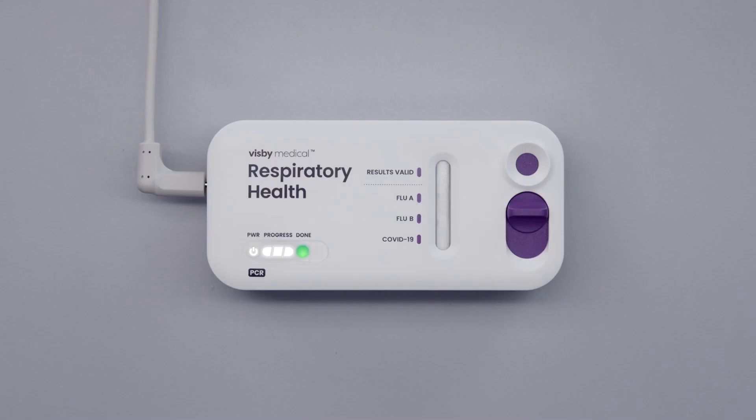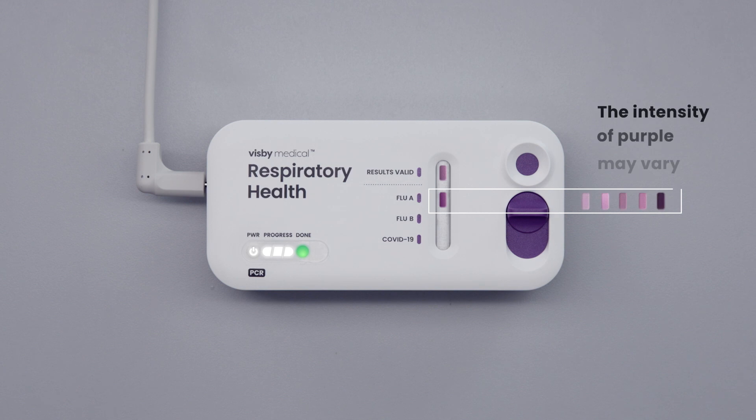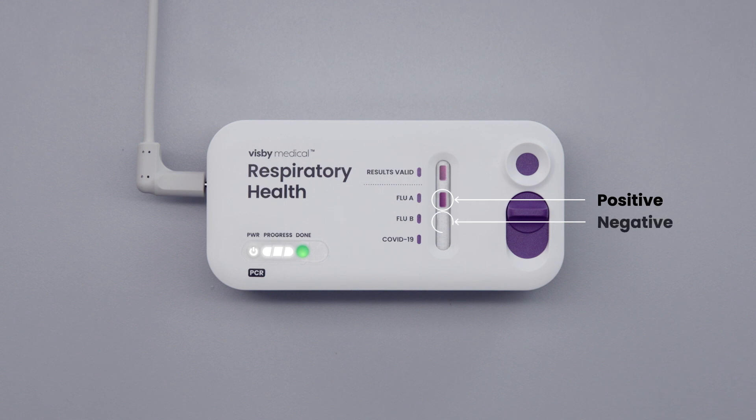Once the test is complete, a purple spot next to results valid indicates the test is valid. If the test is valid, any shade of purple with distinct edges is considered a spot. The intensity of purple may vary. For this example, the sample is positive for flu A and negative for both flu B and COVID-19.